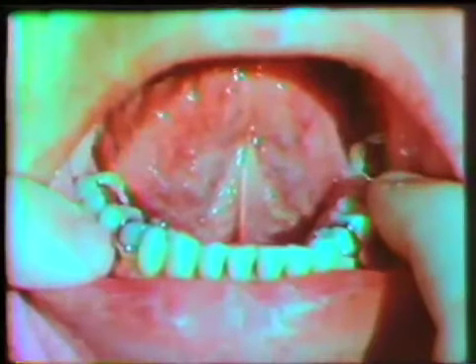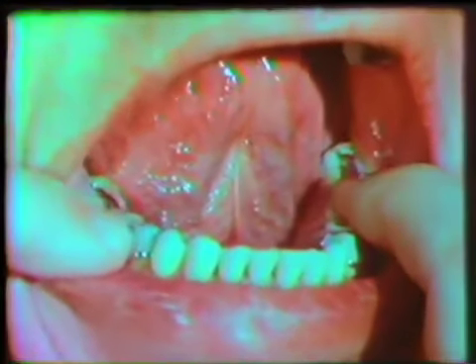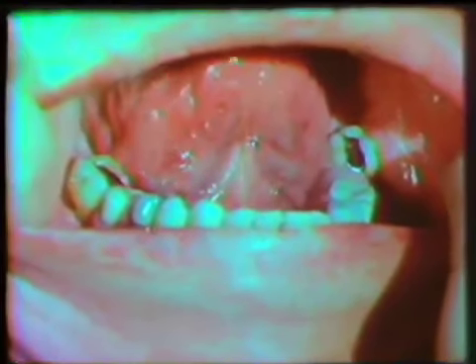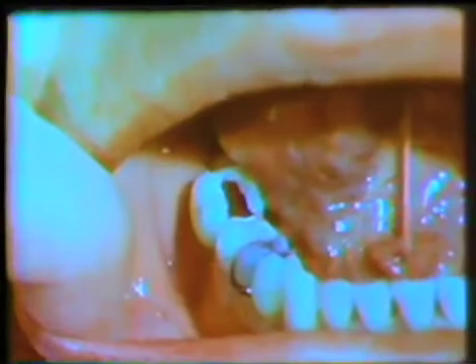The advantages of this type of partial denture design become apparent in this patient. Each molar abutment is free of clasp arms, and if the rest preparation is adequate, the occlusal rest with its minor connector will provide all the basic requirements of a clasp assembly. Other advantages include minimal tooth coverage, ease of oral hygiene maintenance since the appliance is removable, minimal tooth preparation, and a reduced chance of distortion since the posterior retentive components are rigid.